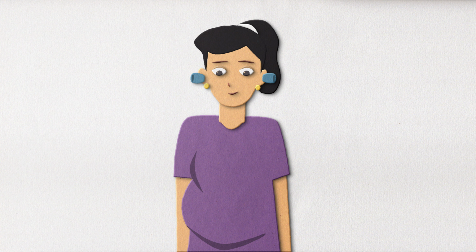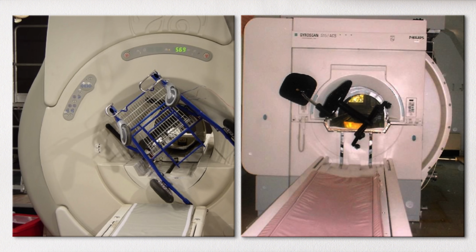There are also other safety concerns with MRI scans. Because they use powerful magnets, patients have to let the radiologist know if they have pacemakers or metal in their bodies, so they can avoid things like this from happening.